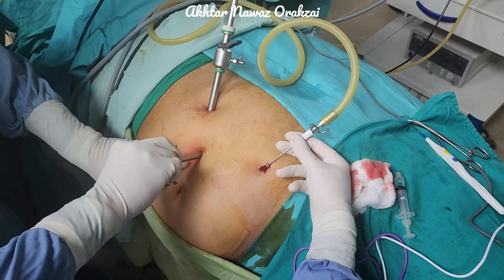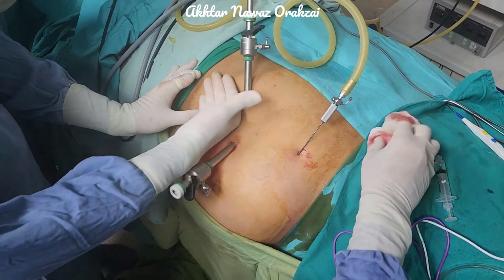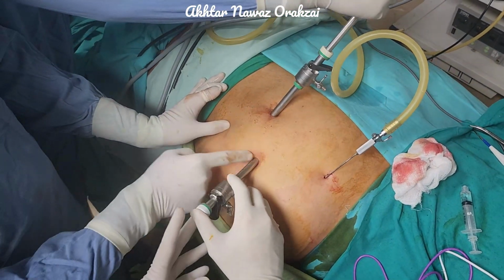And another working port will be 10 centimeter and then 7 centimeter, so it will make a perfect triangle here.